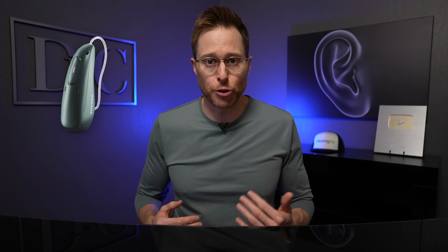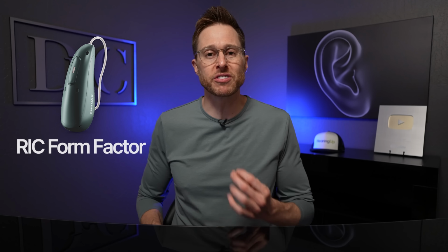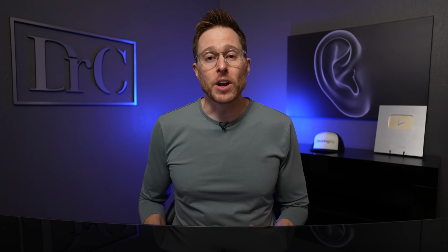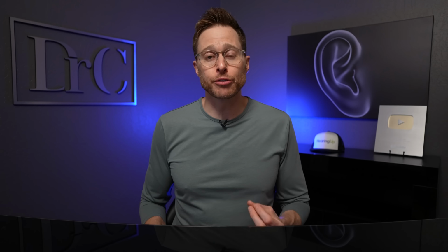The Sphere Infinio hearing aids only come in a rechargeable receiver in canal form factor. So if you're looking for a BTE Sphere Infinio or an ITE Sphere Infinio, you're out of luck. Of course, if you want a non-Sphere version of the Custom Virto Infinio hearing aids, they do have that option for you. It just will not have the DeepSonic chip.